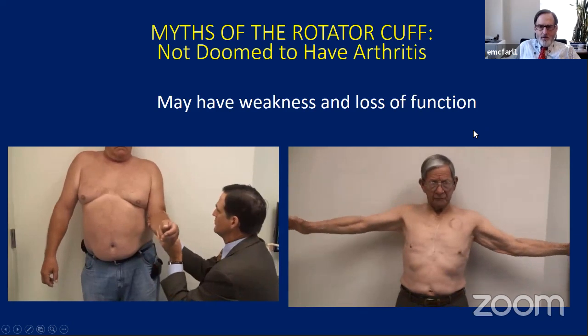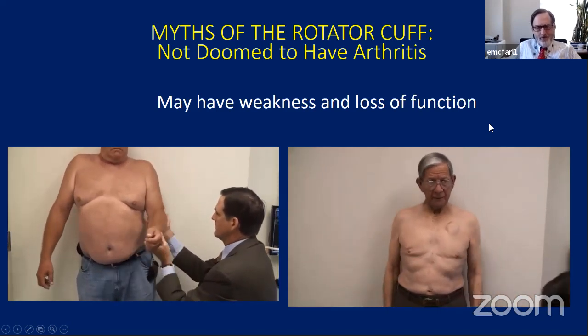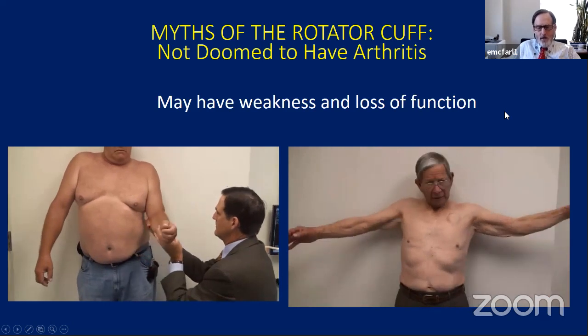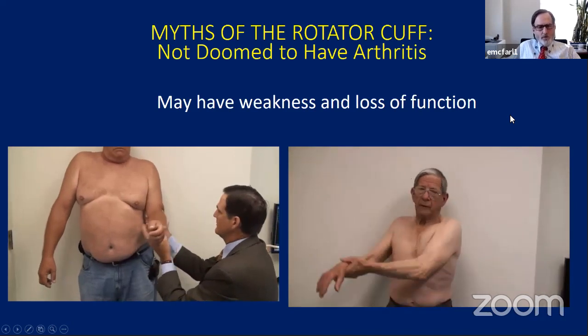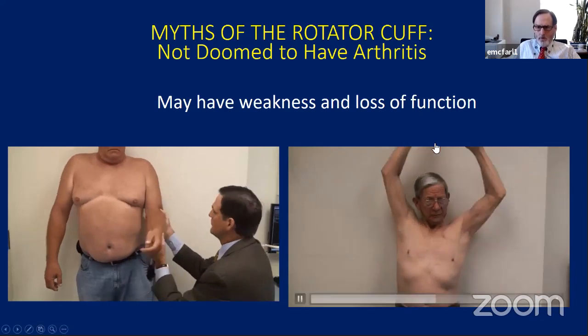He's not the kind of guy that probably would benefit from a reverse total shoulder arthroplasty. Like anything, some things are good for some indications and not others, so you have to be very careful in your patient selection, particularly if you're going to start doing these. The best patients are those that have pain, because you'll end up being a hero and not a chump.